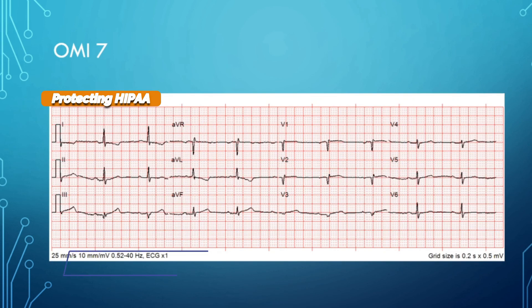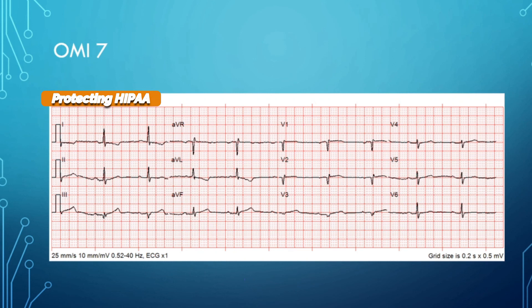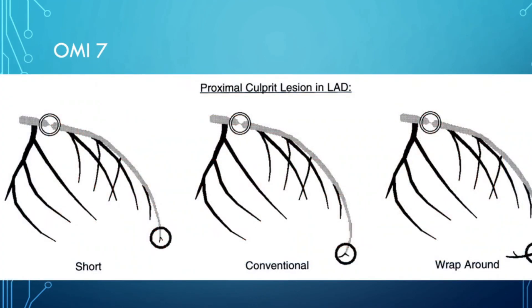This case is very similar — hyper-acute T waves in the inferior leads with well-formed Q waves in V1 and V2, and the precordial T waves look hyper-acute as well. This could be a type 3 wrap-around LAD occlusion. That pattern appears when you get ST elevation in the precordial leads combined with elevation in the inferior leads because the LAD wraps around the bottom of the heart.